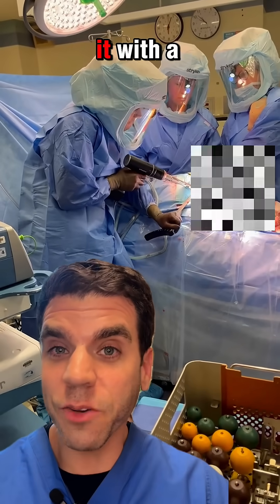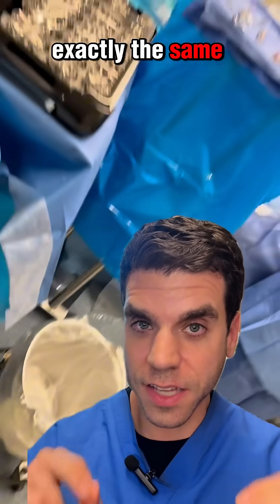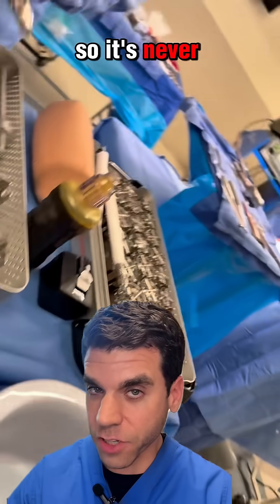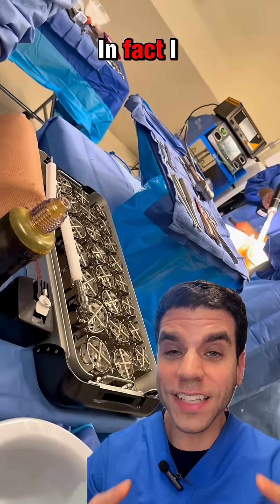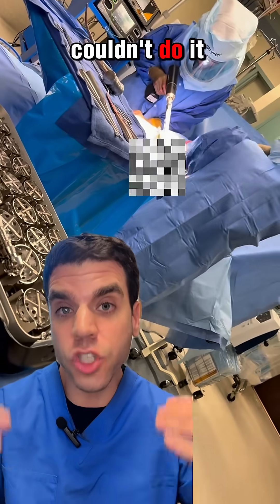But now, instead of me hitting it with a mallet, this thing impacts it for me. Each tap has exactly the same pressure that's regulated, so it's never too hard and never too soft. In fact, I even tried to break a cadaver bone in a lab once, and I physically couldn't do it.